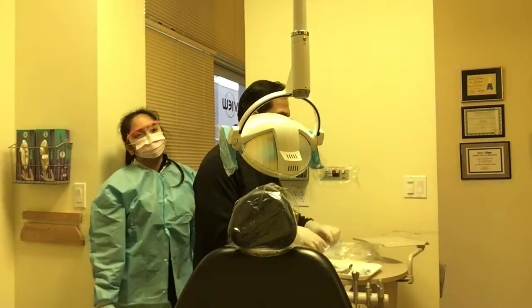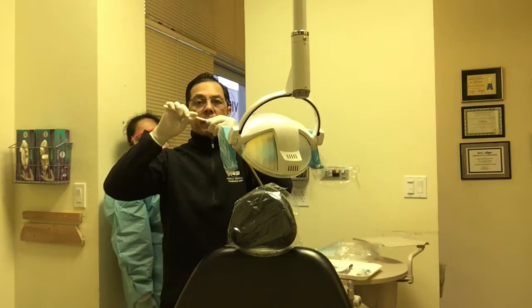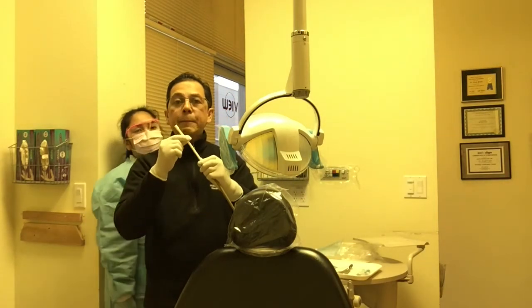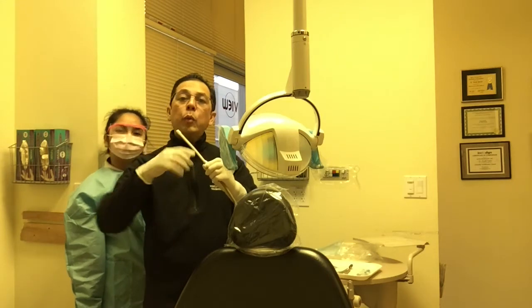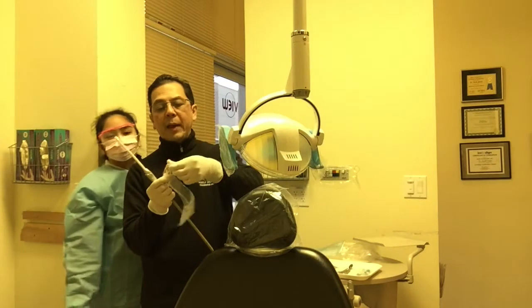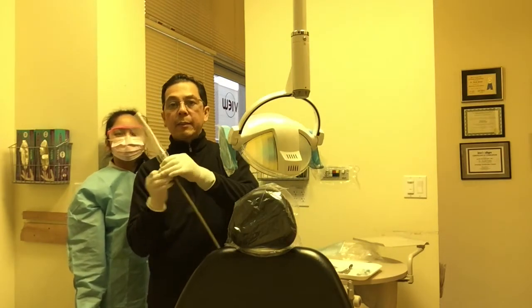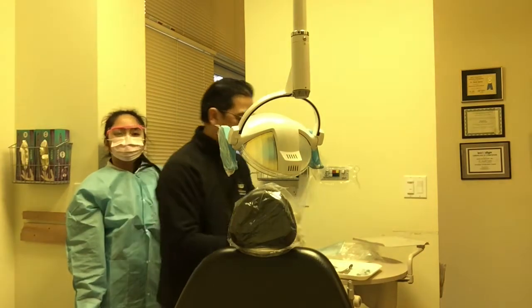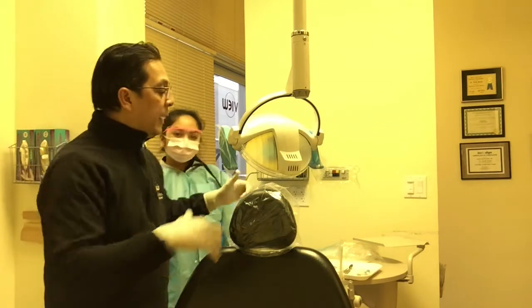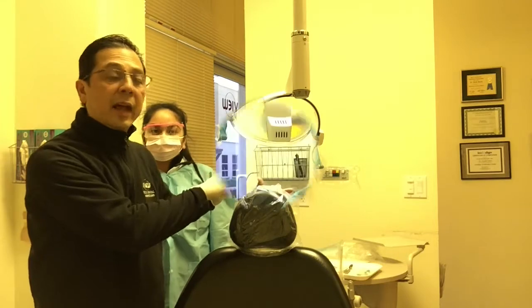Before we do that, we're going to go ahead and put in the suction, which looks just like this. This is a disposable, so after we use it, we go ahead and throw it away. But one of the things that we also do here is we're going to put plastic on top of the suction tip like this. As we see our patients, all that will be sterilized at a later time.